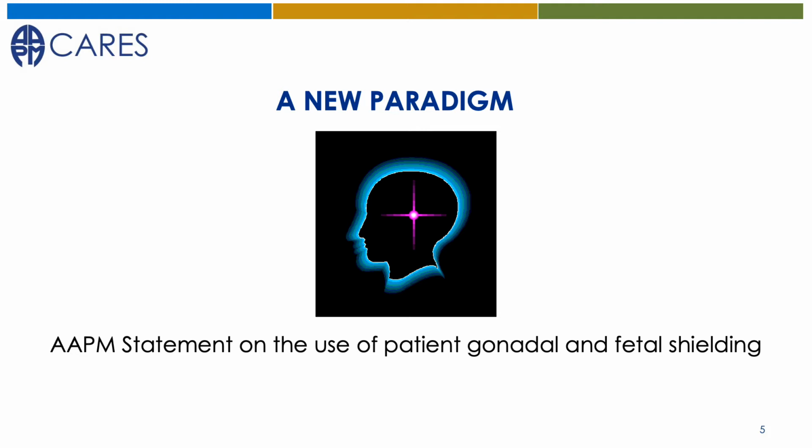The AAPM statement was intended to be the beginning of a much larger conversation, one that includes many other stakeholders, organizations, and individuals. Its purpose is to educate the imaging community that these fetal and gonadal shields provide no tangible benefit to patients, may compromise radiologic examinations by interfering with important patient anatomy, or may actually increase patient dose to more sensitive organs such as the stomach and colon when placed in the X-ray beam path and detected by an automatic exposure control system.